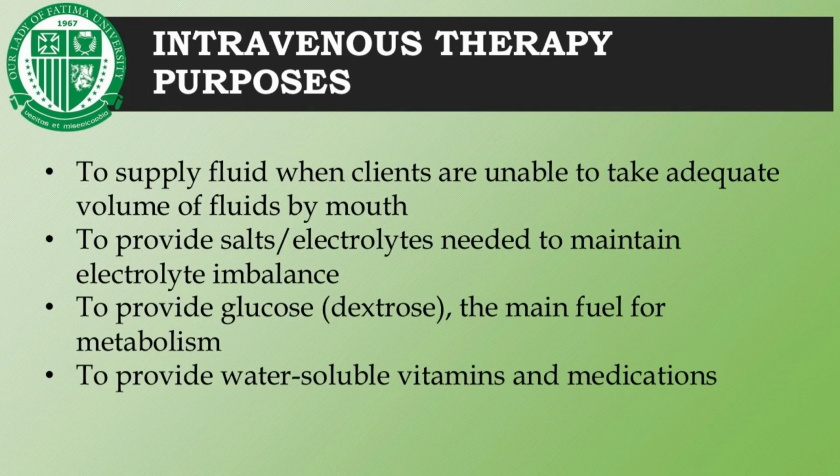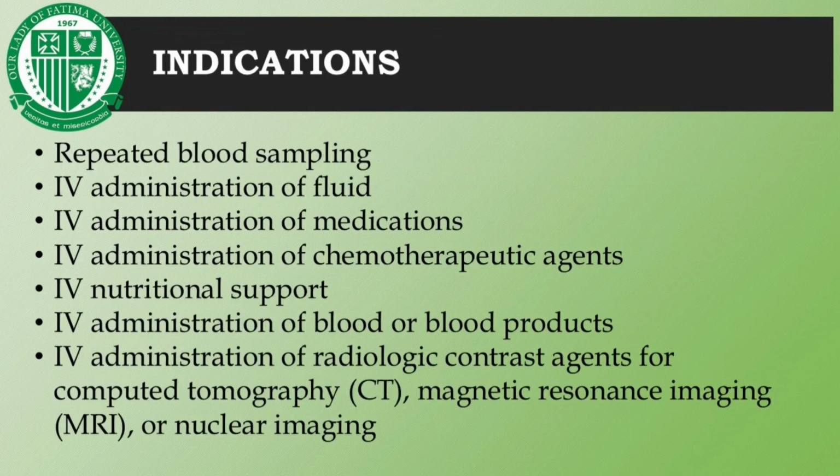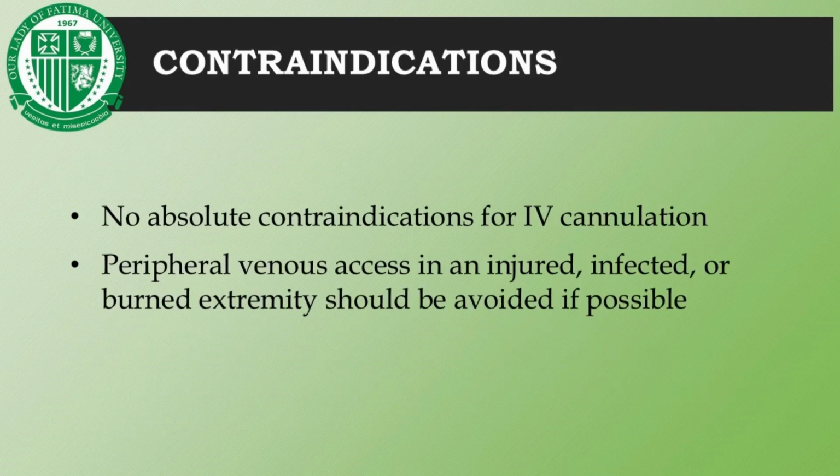and medications. Indications for IV therapy are the following: repeated blood sampling, IV administration of fluid, medications, chemotherapeutic agents, IV nutritional support, IV administration of blood or blood products, and radiologic contrast agents for computed tomography, CT, magnetic resonance imaging, MRI, or nuclear imaging. There are no absolute contraindications for IV cannulation.